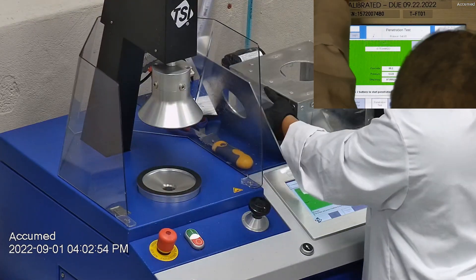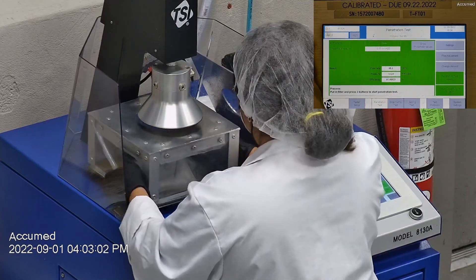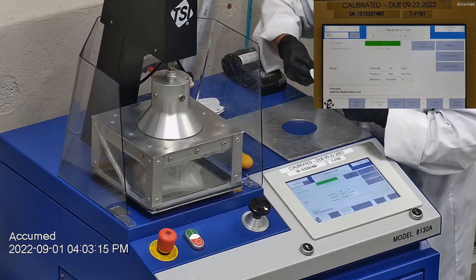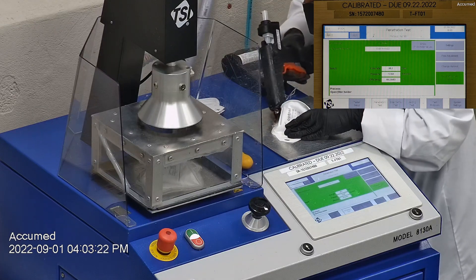F stands for air flow rate, which we test at 85 liters per minute. R is for resistance, also referred to as pressure drop — this correlates with breathability, so the lower the number, the more comfortable and breathable the mask is. E stands for filtration efficiency percentage.